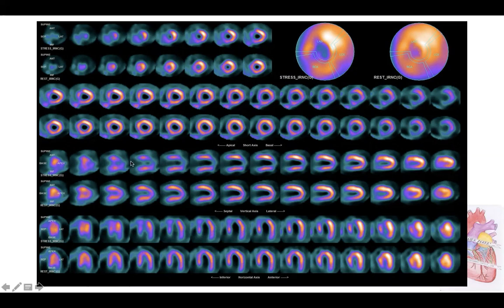It is very simple, because if you observe this area versus this area, you can see that there is a large amount of perfusion abnormalities in the apex, in the anterodistal portion of the anterior wall, and also in the medium and distal portion of the septal wall.